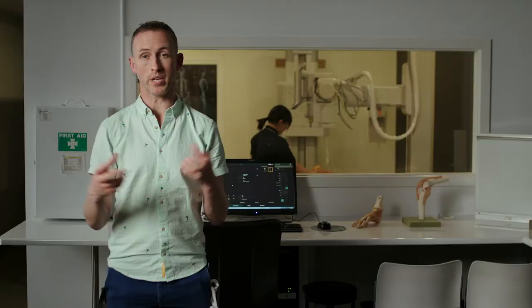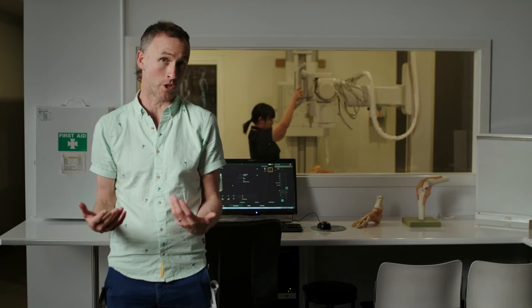We're taking a three-dimensional structure and visualizing that on an x-ray image, which is two-dimensional, and therefore you need to take the image from different angles such that you can represent that appropriately so that we can make sure we get an accurate and confident diagnosis.